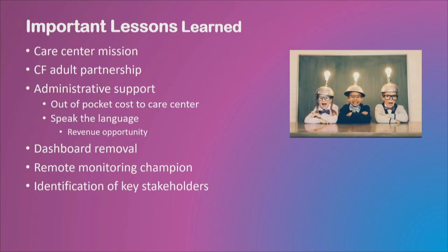So, lessons learned. Obviously you want to stick to your care center's mission, and that really was to continuously provide high quality care. And we really couldn't do that in the telemedicine platform without spirometry. I thought it was quite important for us to have it because at the time there still wasn't a vaccine in 2020. So we really wanted to get most of these people on and be able to see if they were in fact having symptoms of COVID. And we wanted to make sure we could see that quickly.